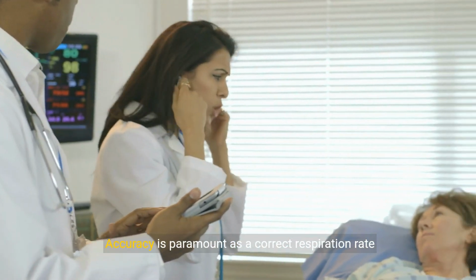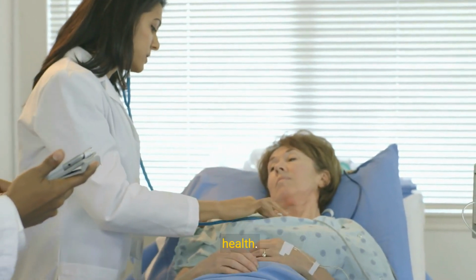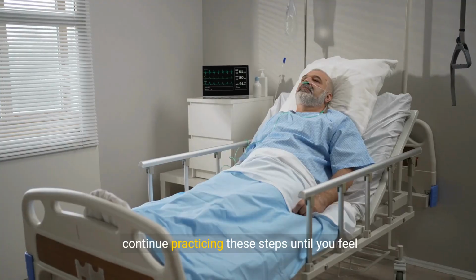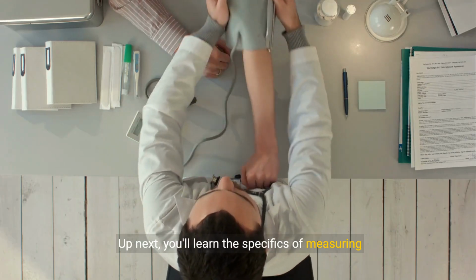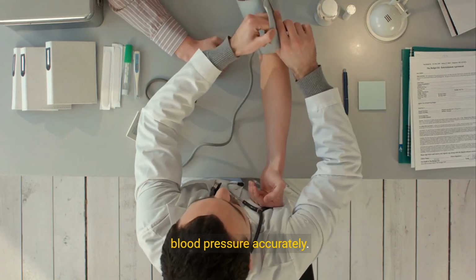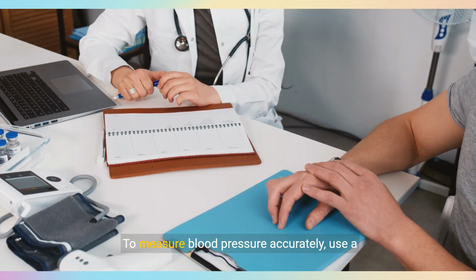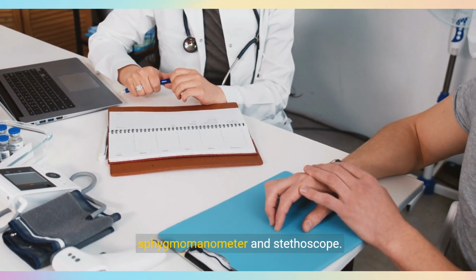Accuracy is paramount as a correct respiration rate is vital for assessing a patient's respiratory health. Now that we've covered measuring respiration rate, continue practicing these steps until you feel confident. Up next, you'll learn the specifics of measuring blood pressure accurately. Stay tuned. To measure blood pressure accurately, use a sphygmomanometer and stethoscope.